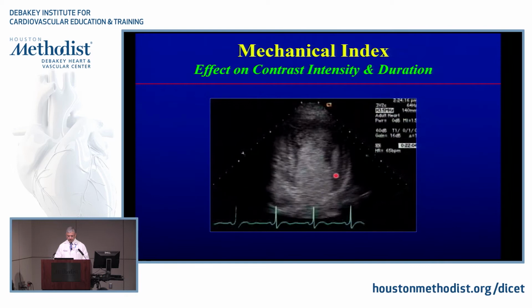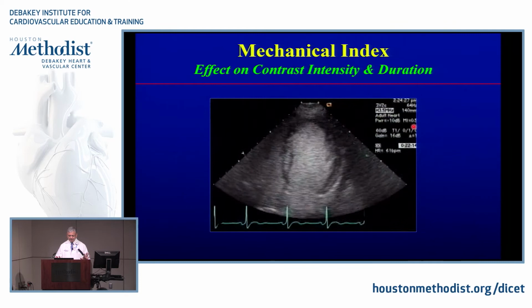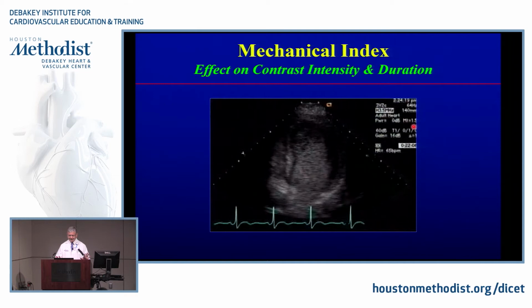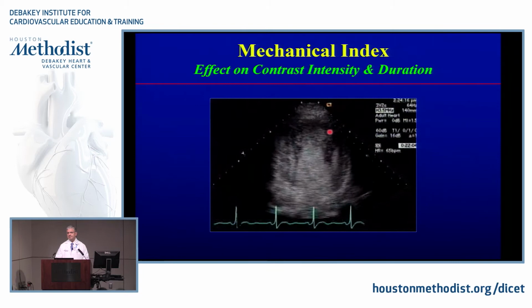High mechanical index, see how it is? A lot of destruction, particularly close to the apex. I'm going to start coming down. There you go, point something, whatever it is. Watch. Fills it very nicely. We'll do it again. There you go, high mechanical index. Lower, watch. It fills all the way to the apex very nicely. And this is almost instantaneous.